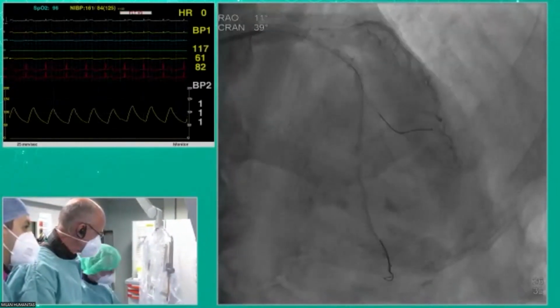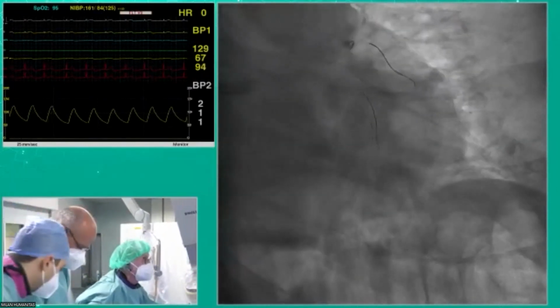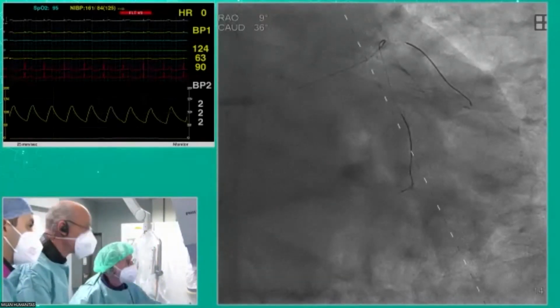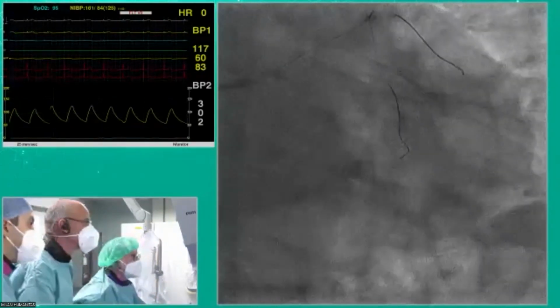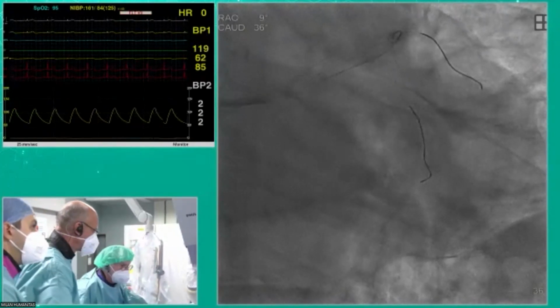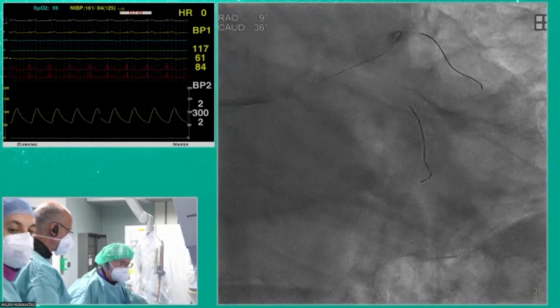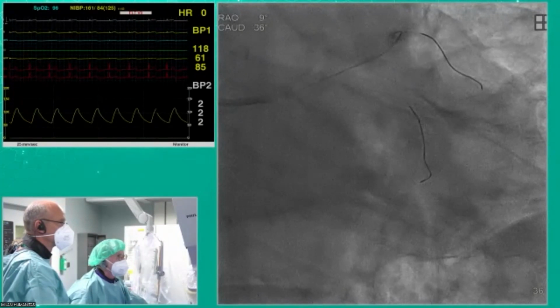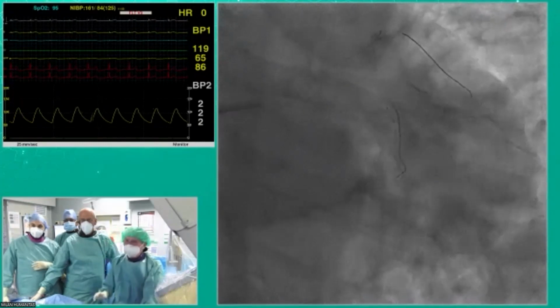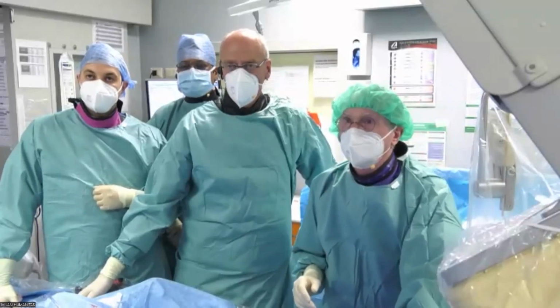So I think for the audience that may have missed Antonio's point, when he was first doing this with DCB only, he was doing a lot of physiology. So he would put a pressure wire down to make sure there was no flow limitation. But as he's gotten more and more comfortable seeing the physiology being okay, he's doing less and less of that. Much less physiology. I used to do physiology to be a little bit safer. I just wanted to have angio and physiology, because I didn't want to put the patient at risk. But now it's almost 1 year that I almost stopped doing physiology, unless I have any doubt. But if I have doubts, maybe I place a stent. Okay, this is an RAO.